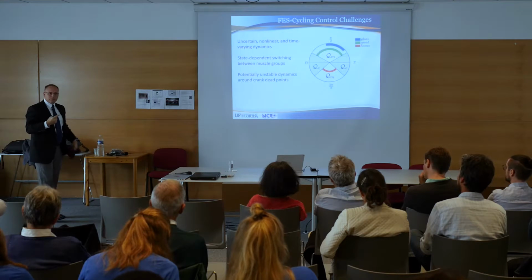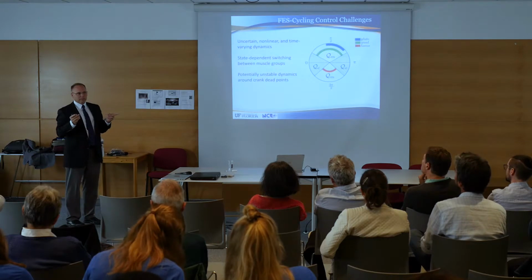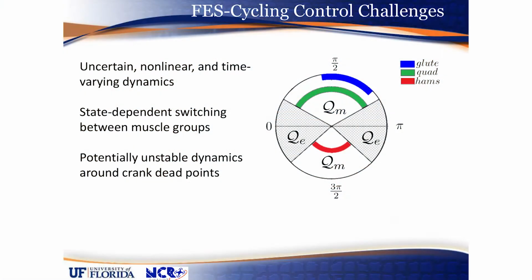And we did tests where we measured the torque output in these different configurations, and then we set a threshold, and we said, well, if you're above this threshold, then we will stimulate in that region, and if you're below this threshold, then it's not very efficient, and we shouldn't stimulate in that region because it'll just fatigue the muscle more rapidly. So now there are different regions throughout the crank cycle where we will want to stimulate different muscle groups because that's an efficient region to stimulate those muscle groups, and then other regions where it's not profitable to stimulate any muscle group.